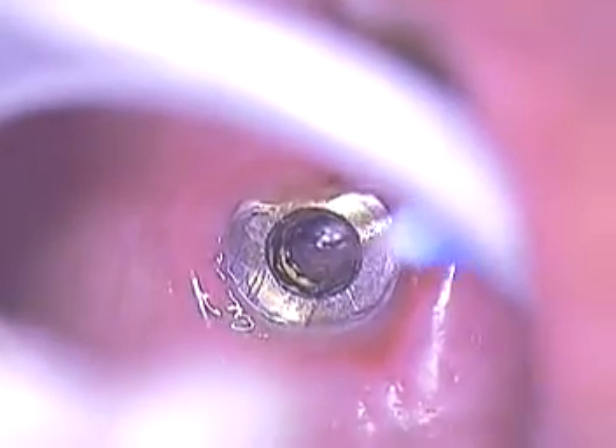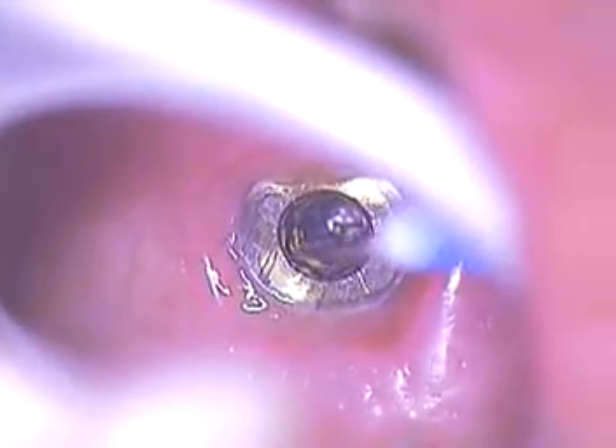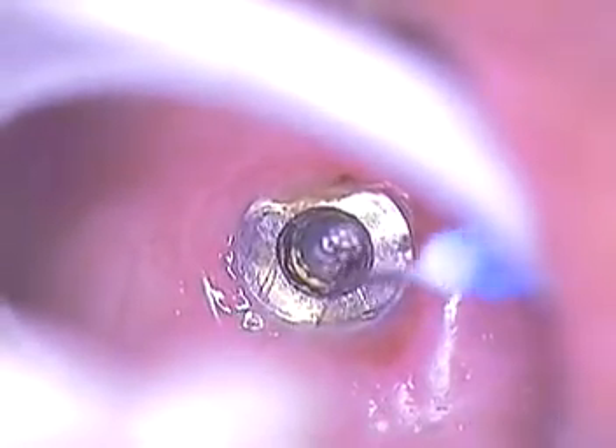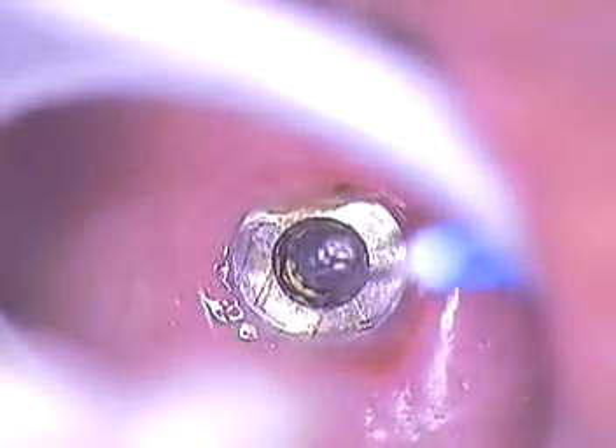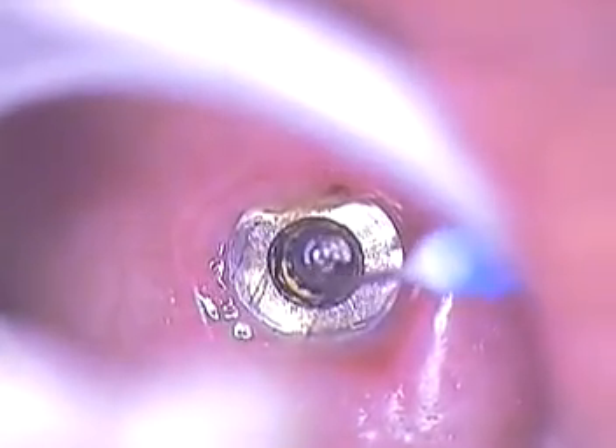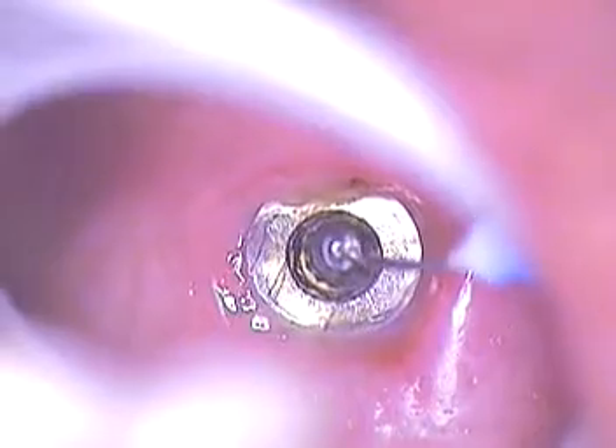This case could have been a disaster if the dentist went in there with any type of rotary instrument, but he stopped, and he saw the video, and he was kind enough to give me a call, and I was able to make this an easy retrieval case.